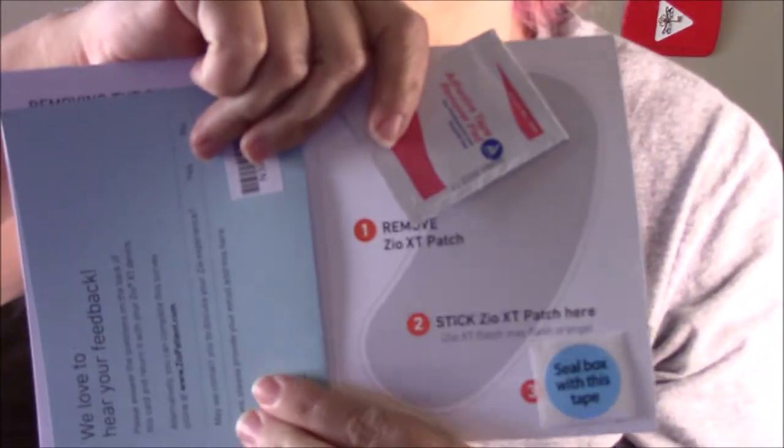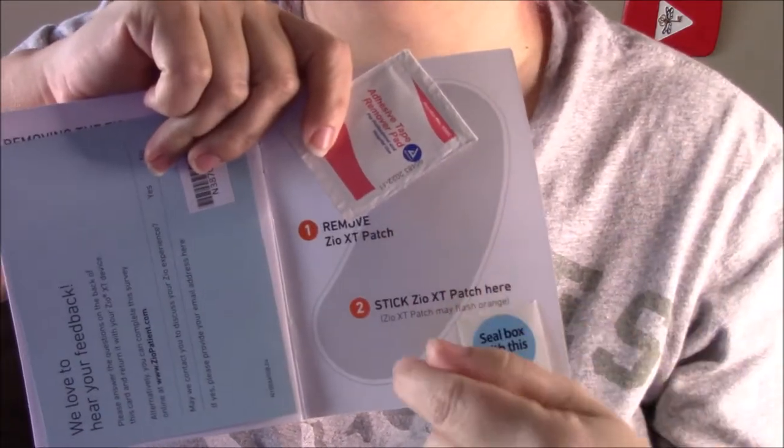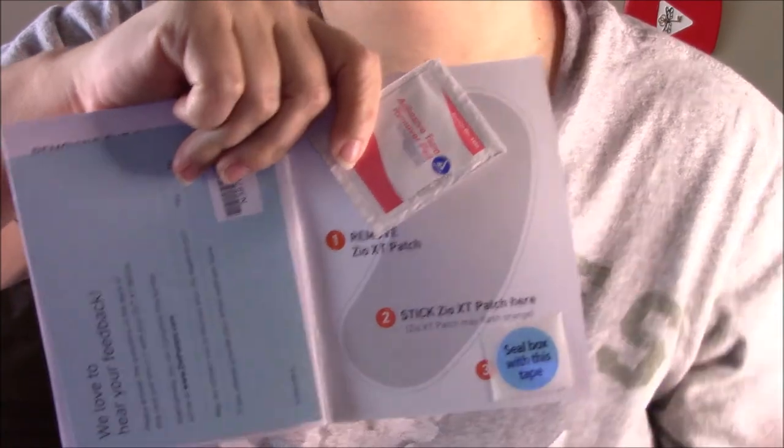I had chest pains last night and honestly it could have been gas — it probably was because it was a tightness in my chest — but I went ahead and clicked it and marked it down. If they look and see her heart was reading normal at that time, well then it was gas, but just in case they have that information. At the end of your two weeks, which is today, you open the back of the booklet — they include adhesive remover — and you peel it off, stick it on the back, put it in the box, seal it up really well, and stick it in your mailbox to be mailed back. I'm a little upset because my mailman already went by early, so it'll go in the mail tomorrow.